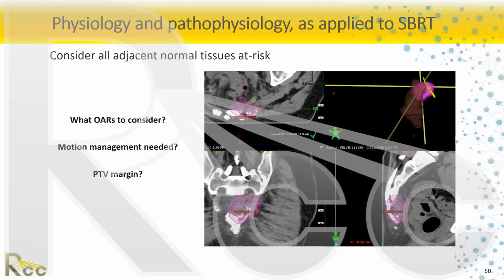If you don't have it available, that's okay. I encourage, for something like a bone metastasis, you add a little CTV margin in the bone in case there is some microscopic disease there. As he taught me, you're not adding it out into soft tissue, say here in the mesorectum.